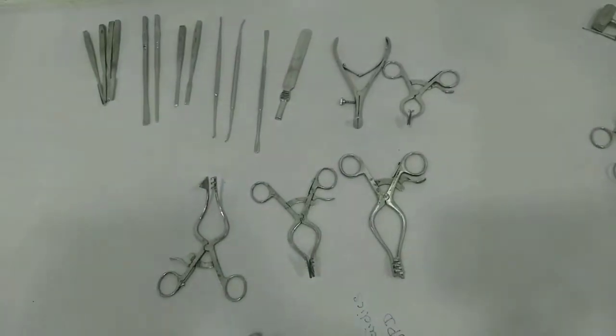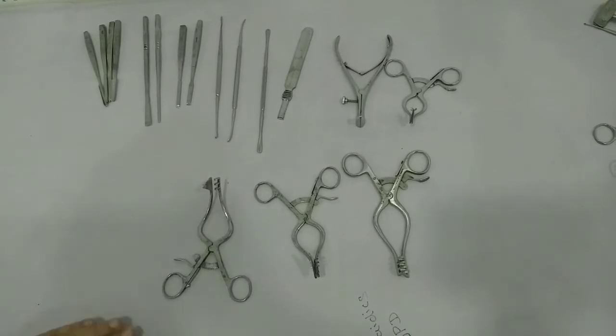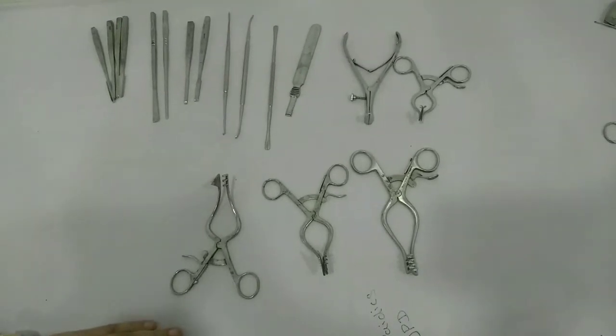Hi friends, good morning. Today I will show you the instruments which are used for ear surgery like tympanoplasty and mastoidectomy. I will be showing you the instruments used for mastoidectomy as well as tympanoplasty.